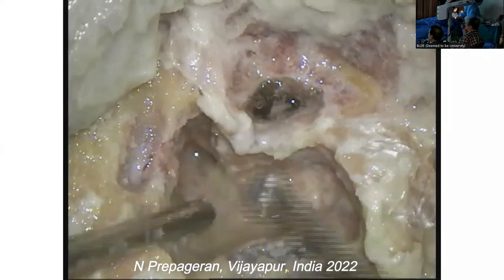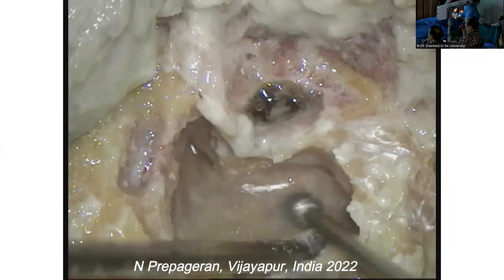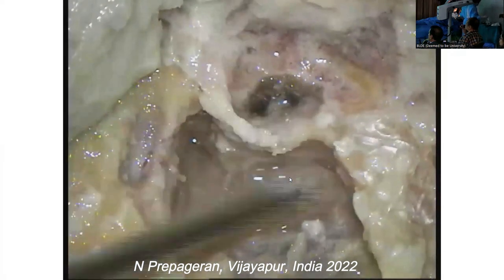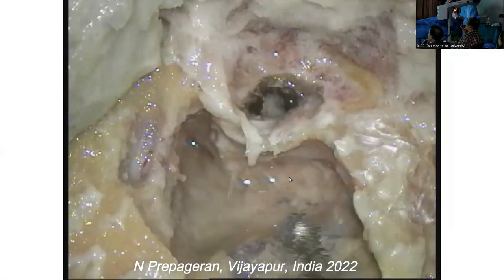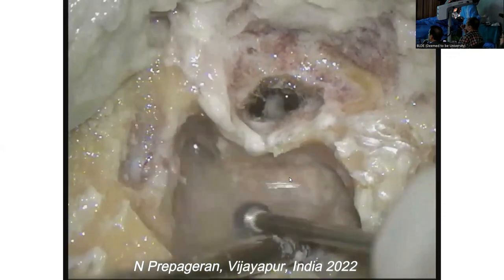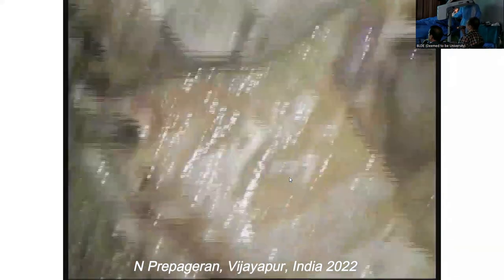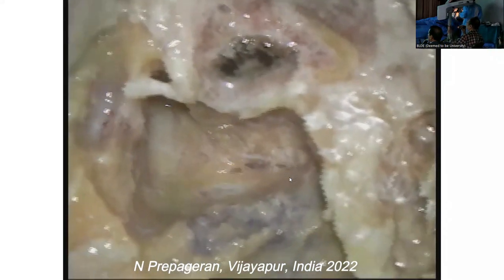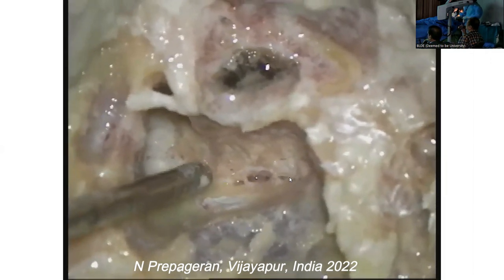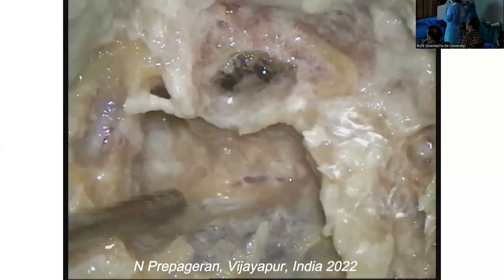Either you can do a Bill's Island technique, or you can just push this down and drill the anterior leg. If you drill this, with the sigmoid sinus coming into view, then you can do the pre-sigmoid exposure. Push it down, maybe with the suction tube. The suction tube can act as a buffer between the drill and the sinus. Can you see the pre-sigmoid dura, the posterolateral dura? Is it clear? Clear, right? Okay, good.